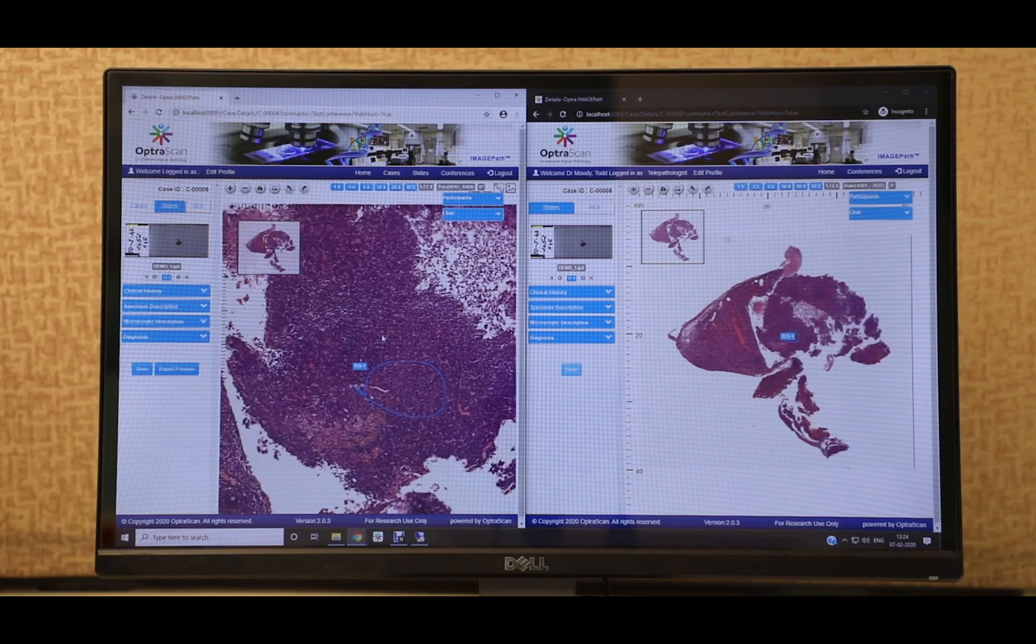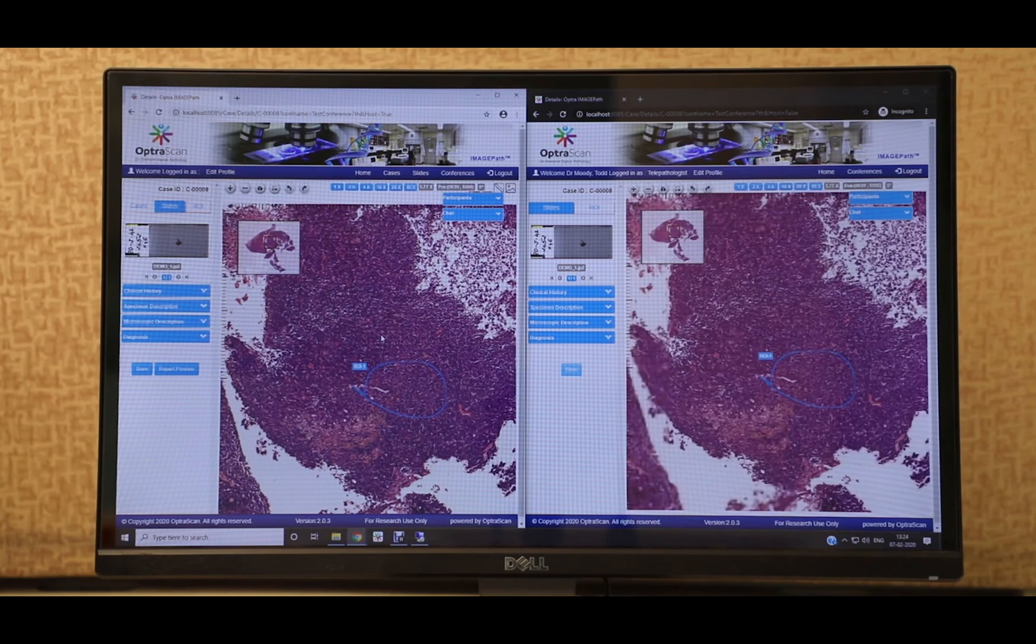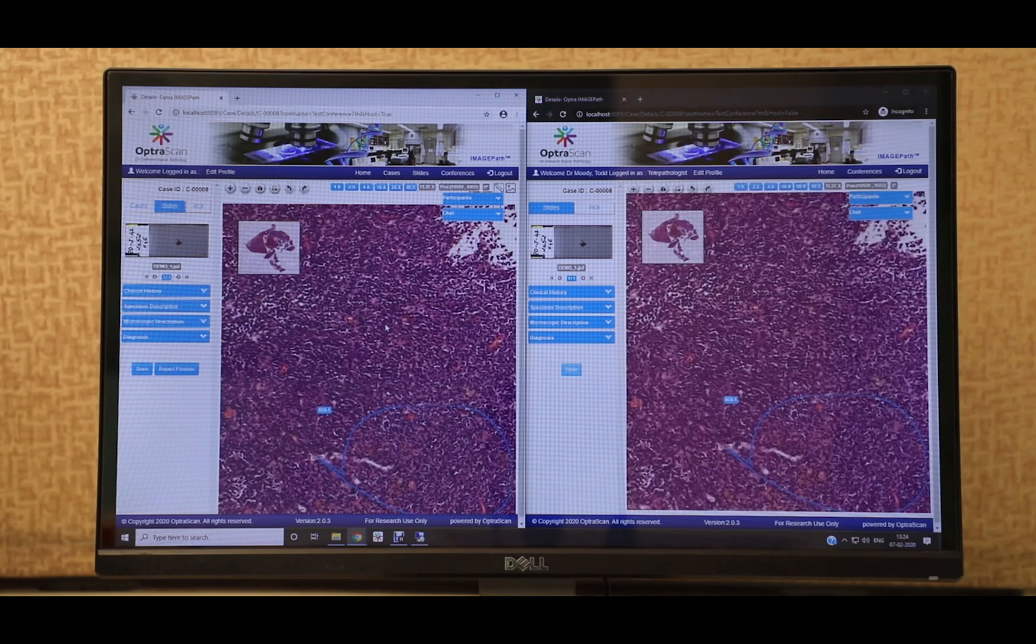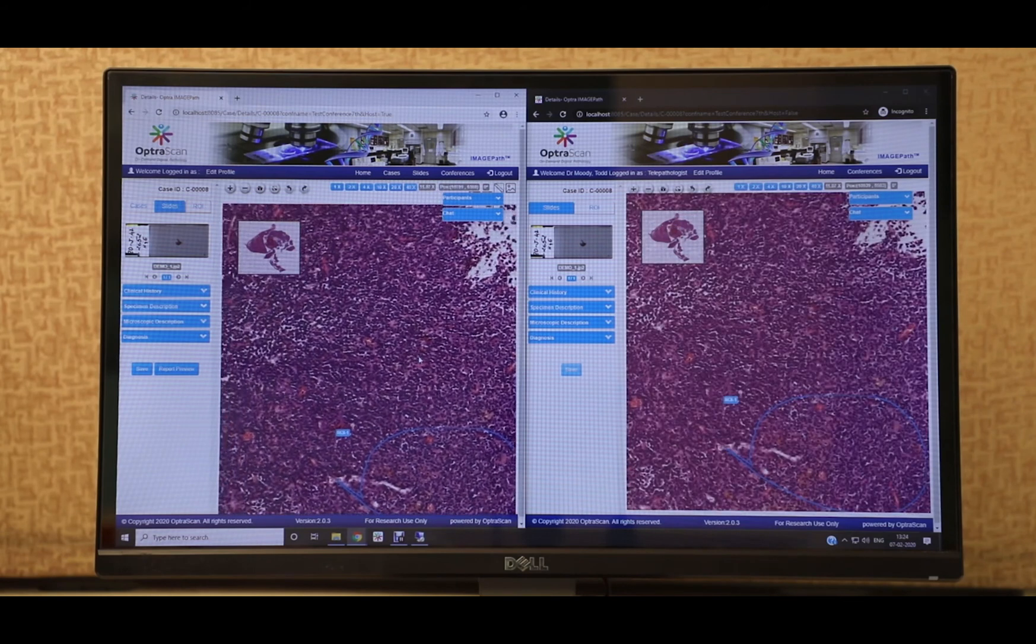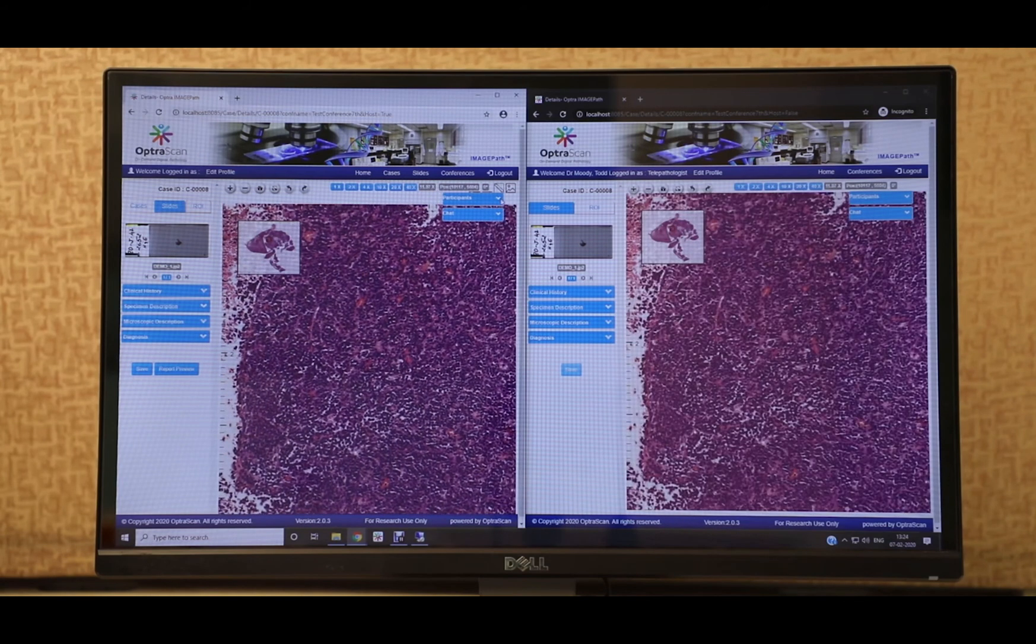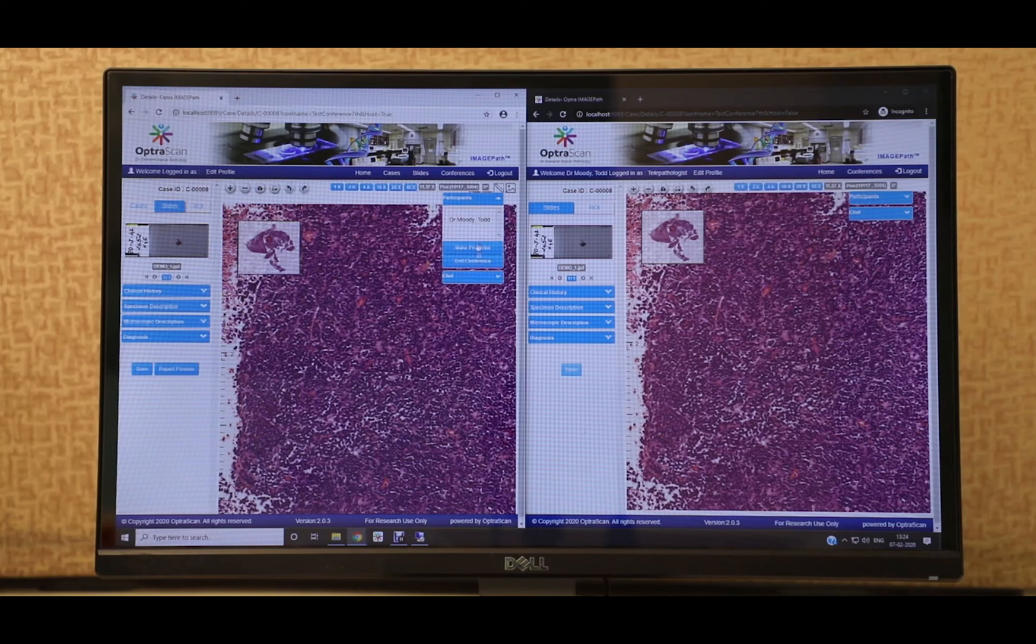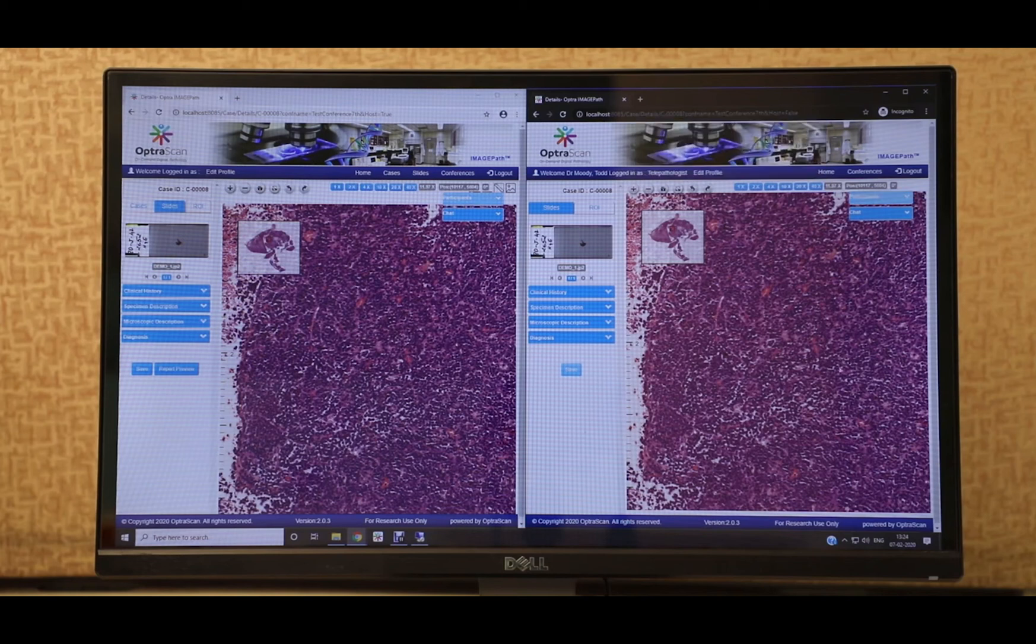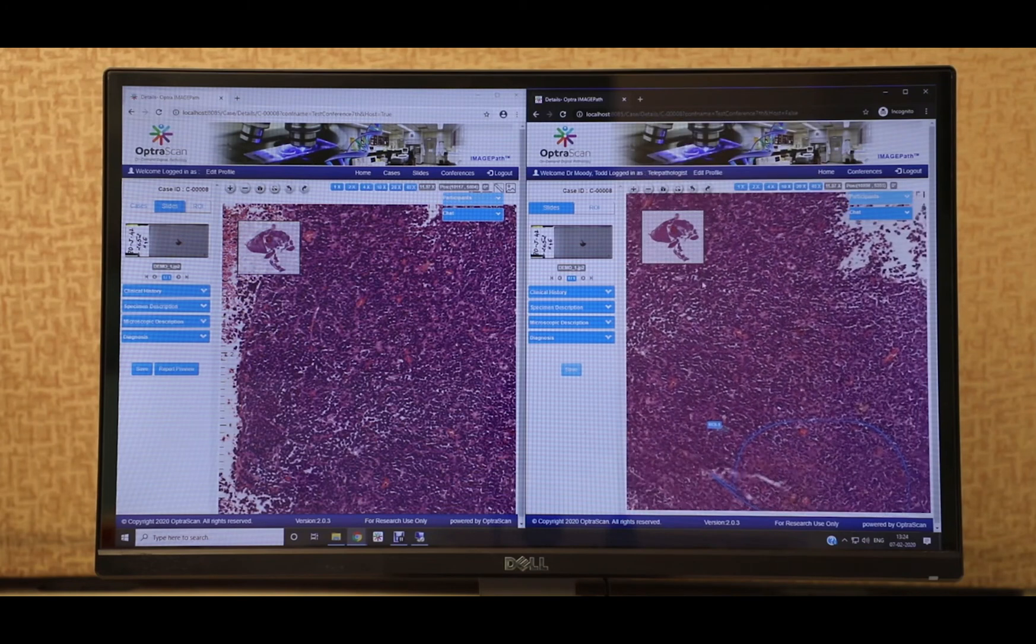When it comes to viewing, the region seen is the same across all attendees' screens. This avoids confusion during the conversation. Control over the image viewing can be passed on to any of the conference attendees, allowing for a two-way conversation.